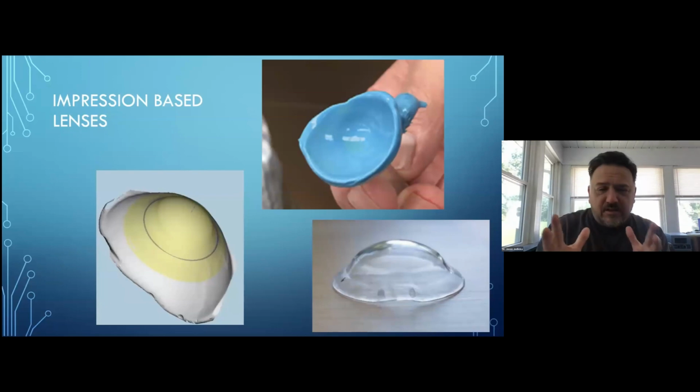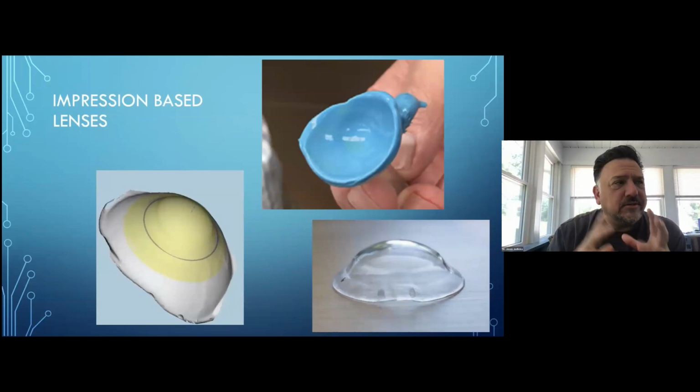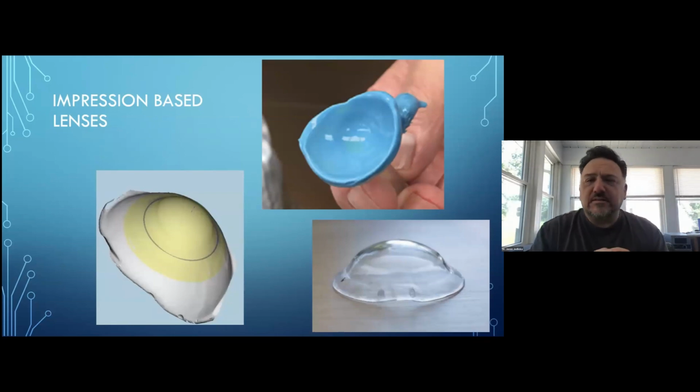And then, kind of the end of the line here, the pinnacle of the most complex and most individualized fitting really is the impression-based lenses. And these are truly amazing to see how they can be so beautifully matched to the shape of the eye. And it's really just a price point thing, right? I mean, if these lenses were a tenth of their cost, we would do them on everybody. So, we do tend to reserve these for those patients for whom the cost is warranted because they have an eye that we know will be very time consuming to fit any other way, even if we can get a successful fit in that way. But impression-based lenses have certainly produced amazing fits for eyes that you would initially look at and think there's no way I'm going to get this thing to fit well.